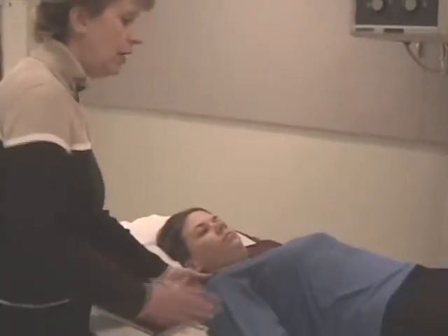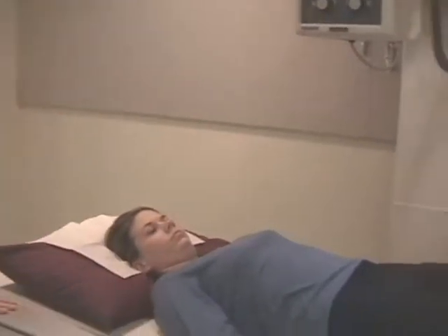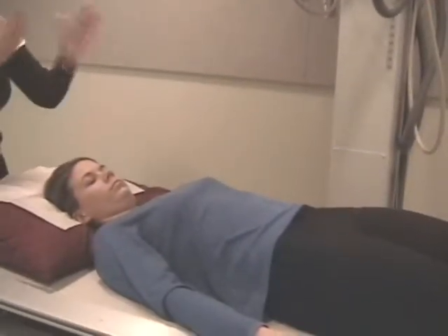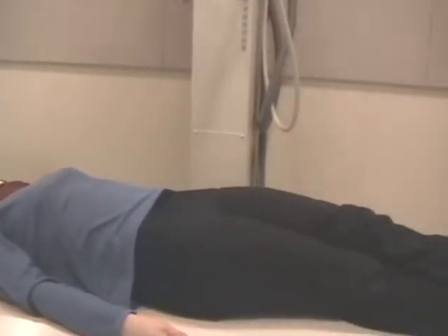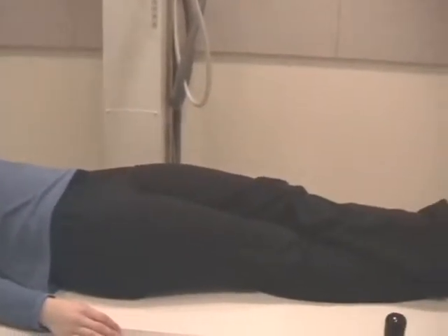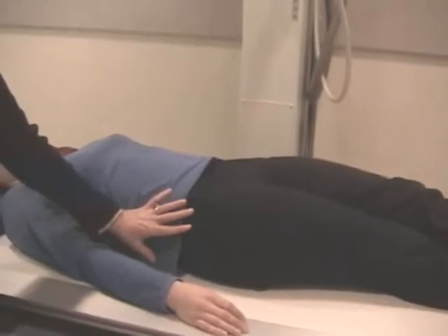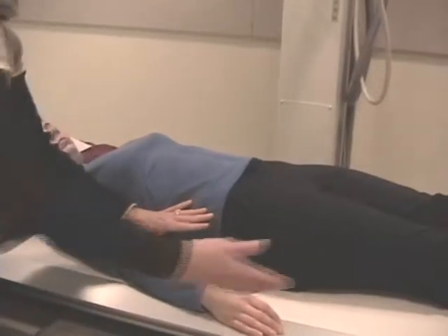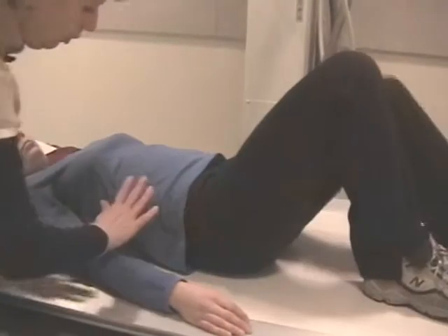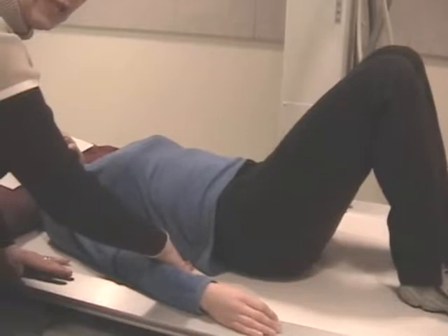I want her flat on the table, and I want her straight on the table. It's a really good idea for you to either step towards the caudal end of the table or come to the head of the table and make sure the patient is straight. I want you to watch here at the patient's waist. I'm going to have the patient bend her knees so her feet are flat on the table. And look what happens to the spine. Did you see how it went closer to the table?